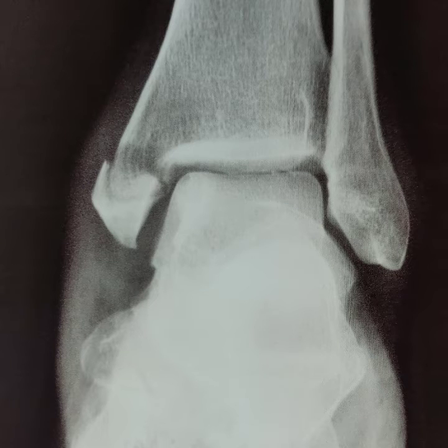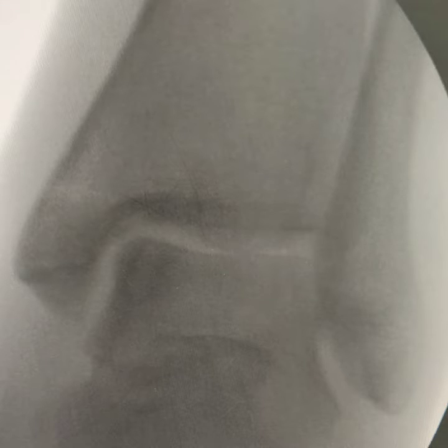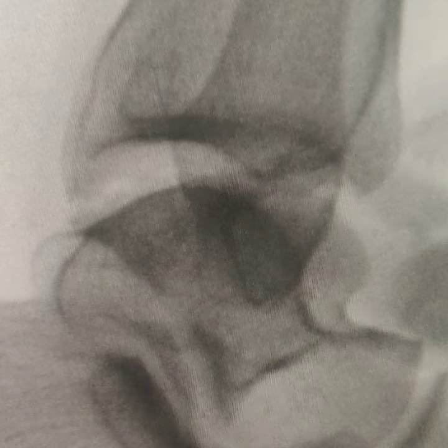X-ray shows isolated medial malleolus fracture. On lateral view, the fracture line runs at the upper level of the talus. Closed reduction is performed under C-arm and fracture alignment is satisfactory on AP and lateral view.